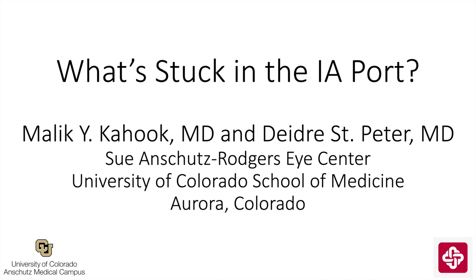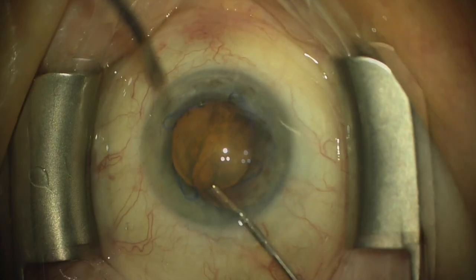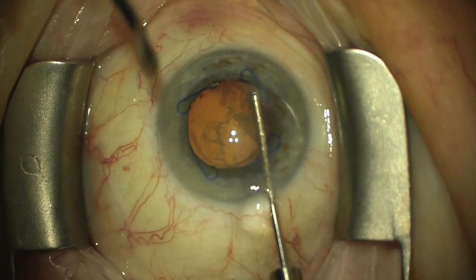The surgery covers a basic learning point for those of you at the early stages of your career as cataract surgeons. The patient in this case has pseudoexfoliation with a visually significant cataract and a poorly dilating pupil. The AC was also very shallow.